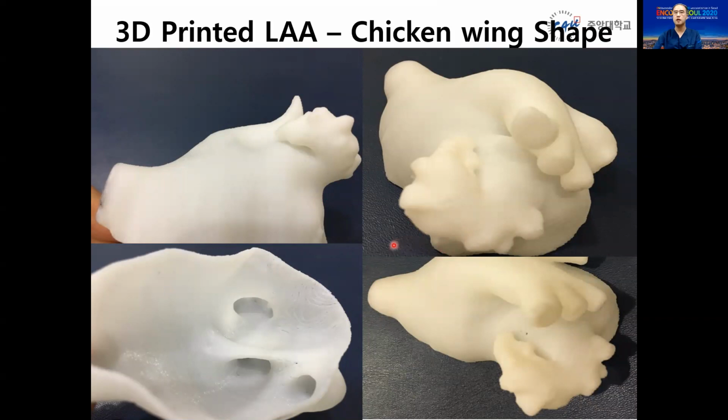Thanks to Dr. Joe's nice work, we could make a 3D left atrial appendage model with high accuracy. With this model, we could grasp the anatomical characteristics of individual left atrial appendages, and we could simulate and plan the procedure with no risk and no time limitations.